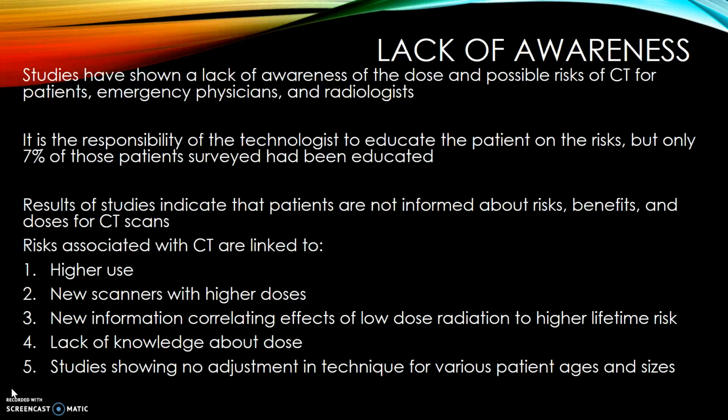Studies have shown a lack of awareness of the dose and possible risks of CT among patients, emergency physicians, and radiologists. It is the responsibility of the technologist to educate the patient on the risk, but only 7% of those patients surveyed had been educated. The results of the studies indicate that patients are not informed about the risks, benefits, and doses for CT scans.